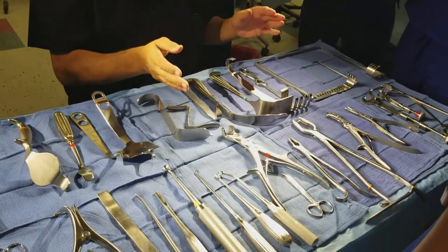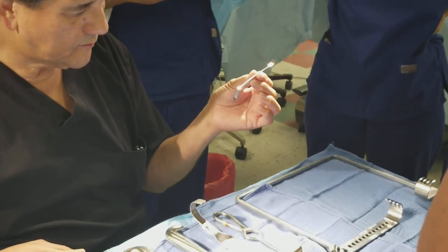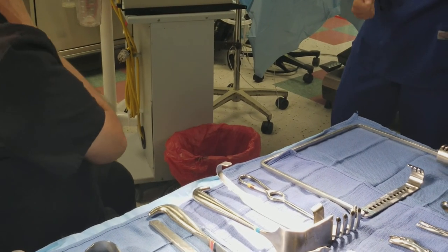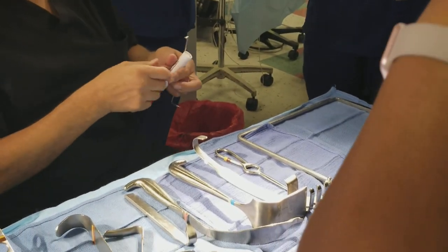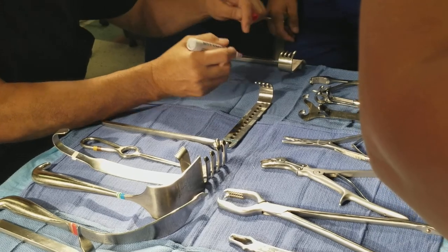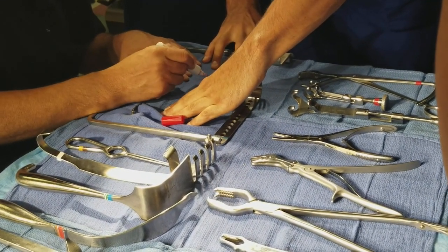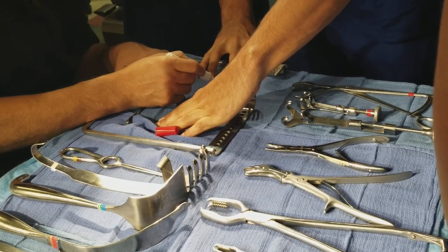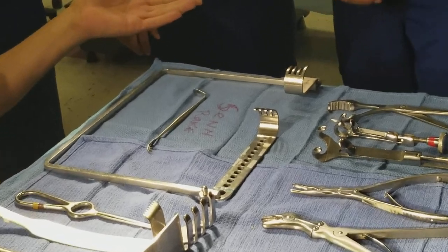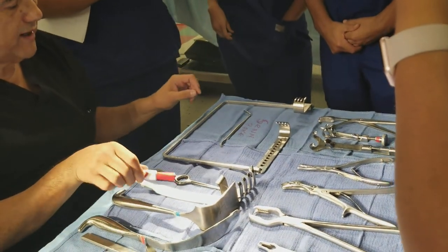We're going to start with this little one that we have not gone over. Pass me a red marker, please. This one here is known as a sen rake — spelled S-E-N-N. It's a retractor; all rakes are retractors. Remember that. The doctor was a — give me a sen. Okay, here's your sen rake.